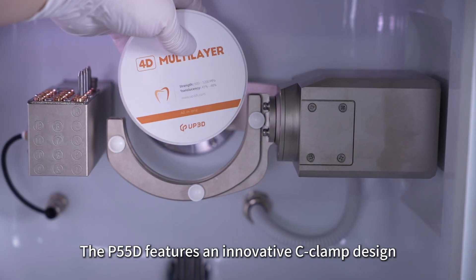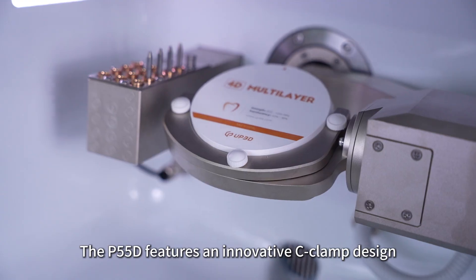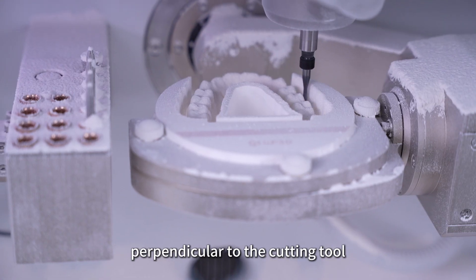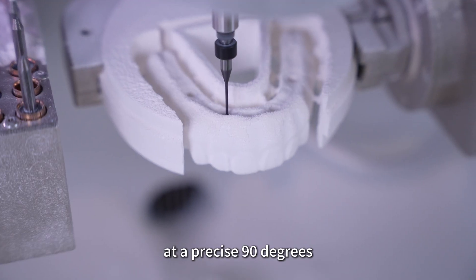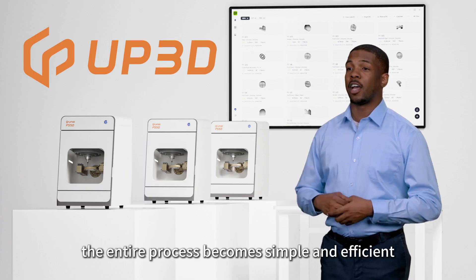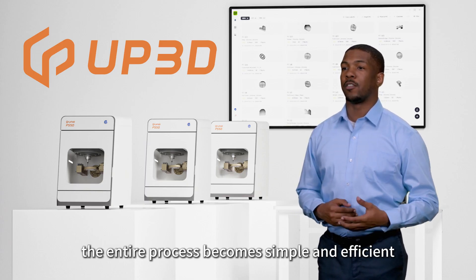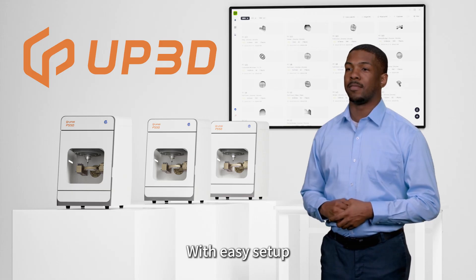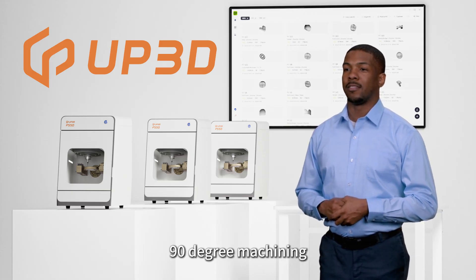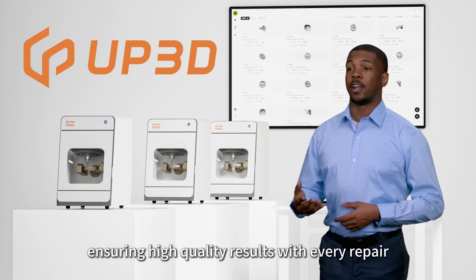The P55D features an innovative C-clamp design that allows specific repair areas to be machined perpendicular to the lathe needle at a precise 90 degrees. Used in conjunction with the UPCAM software, the entire process becomes simple and efficient. With easy setup, the system automatically performs complex 90-degree machining, ensuring high-quality results with every repair.